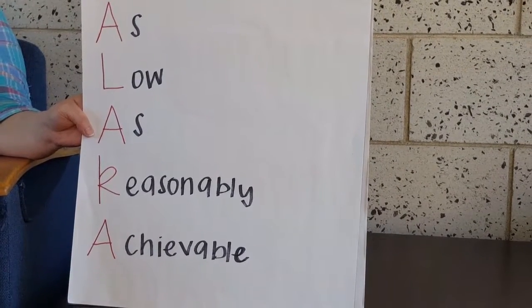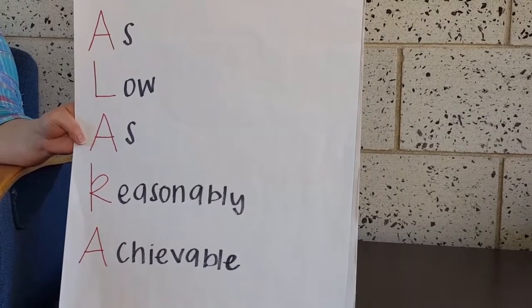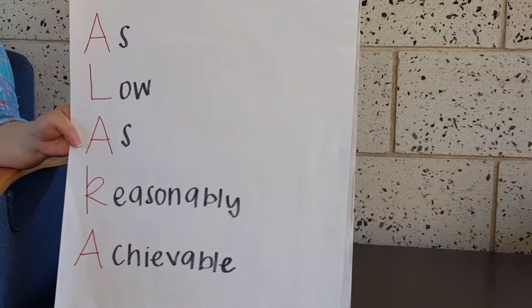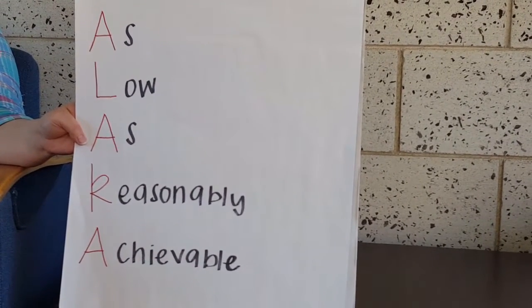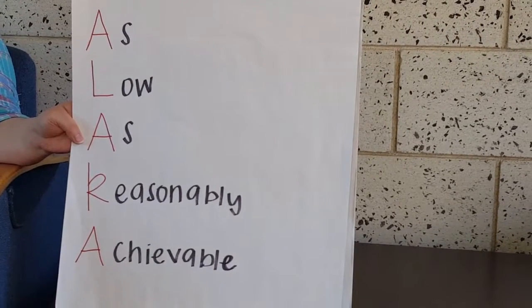The AIUM, the American Institute of Ultrasound in Medicine, states no recorded bioeffects observed due to temperature rises less than or equal to 2 degrees Celsius above normal for exposure duration up to 50 hours.